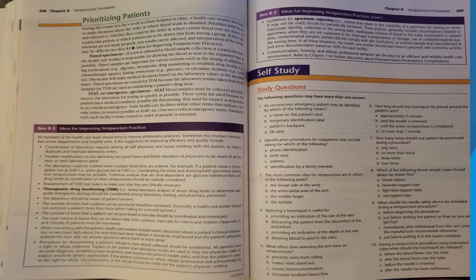During the course of a day's work at a busy hospital or clinic, a healthcare provider may have to make decisions about the order in which blood work is obtained. Priorities must be set and adhered to, whether they concern the order in which certain blood tests are drawn on a particular patient or which patients are to be drawn first from among a group. If these distinctions are not made properly, test results can be affected and interpretation of results may be difficult.